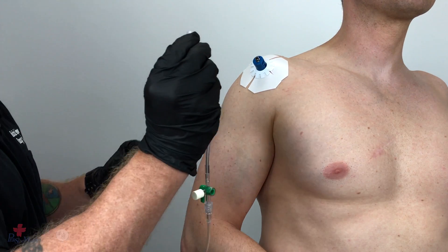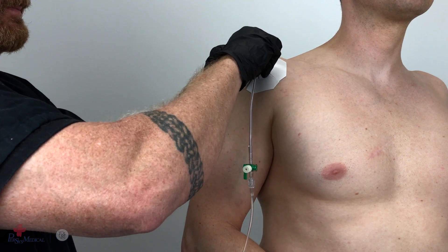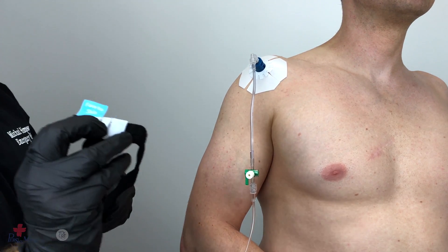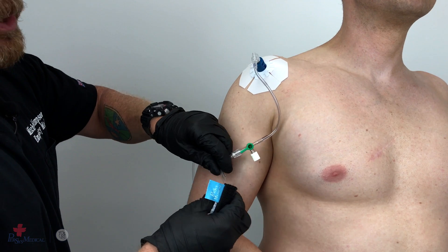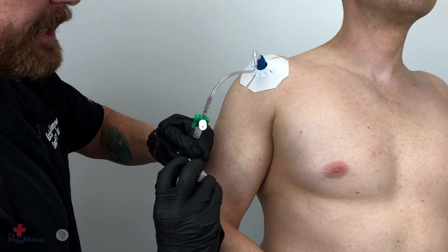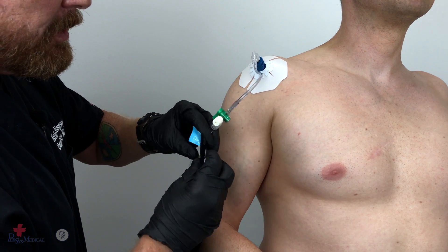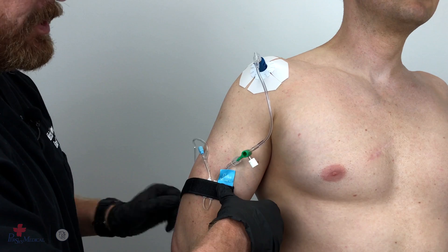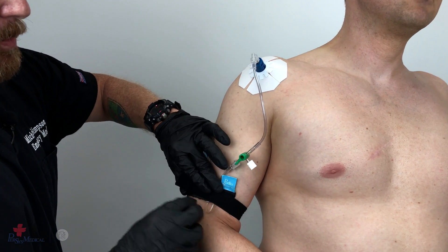Connect the GO-IO tubing to the interosseous catheter hub. Using the secure IV strap, form a loop in the IV tubing and lock it into the plastic channels. Now utilize the velcro strap to secure the tubing to the patient's arm.